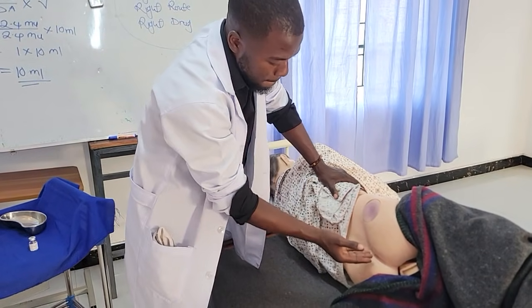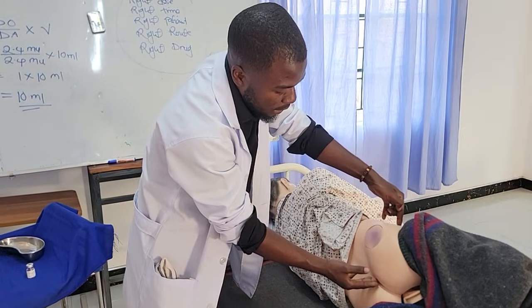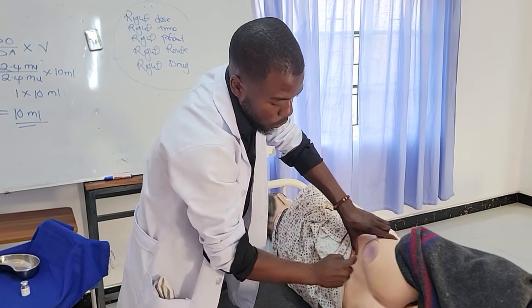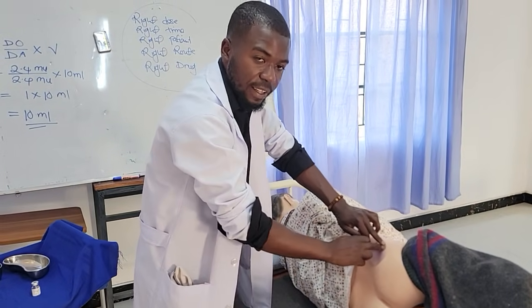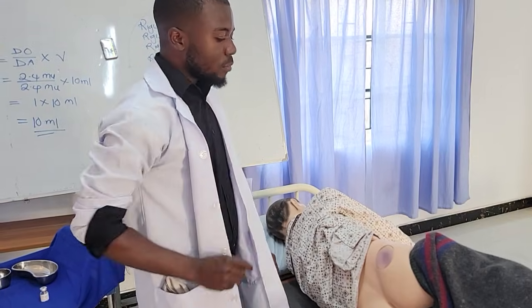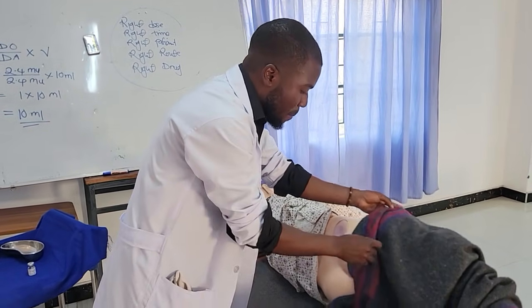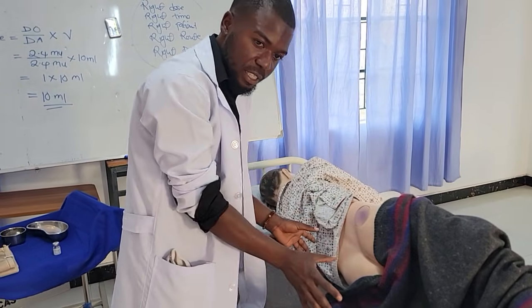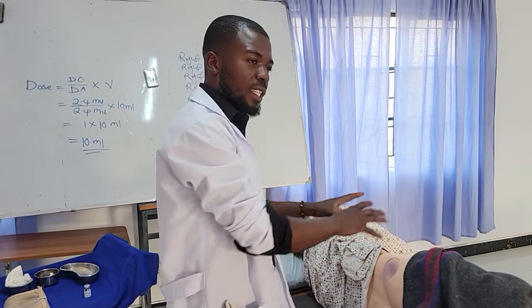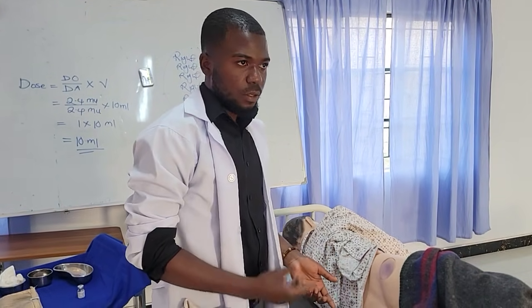So from the middle sacrum to the greater trochanter, a line. Then from the iliac crest to the fold of the buttock, you draw another line. Then we are going to inject on the upper outer quadrant, which is this part. You do the demarcation at this point, then you leave the patient like this. Do not cover the patient, because if you scrub, you're not going to start touching the patient with your bare hands. That means you contaminate.